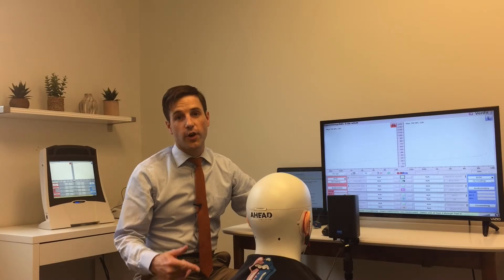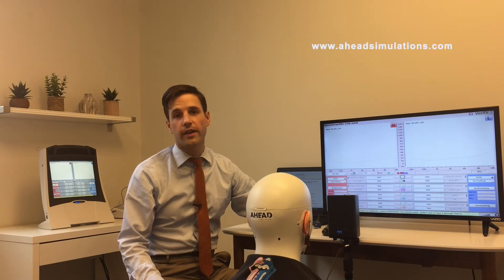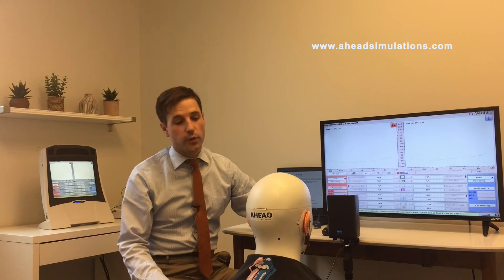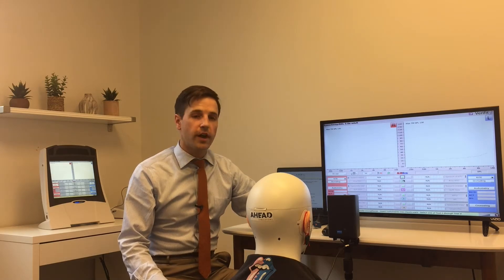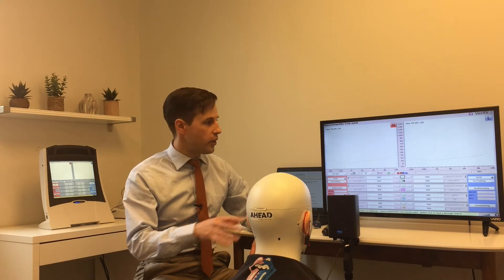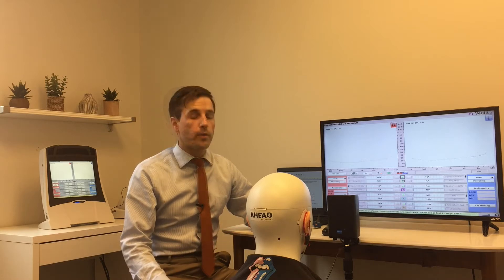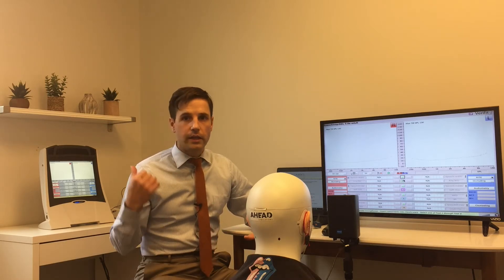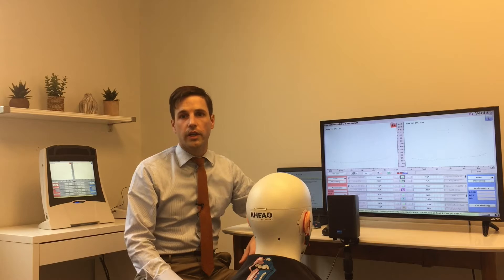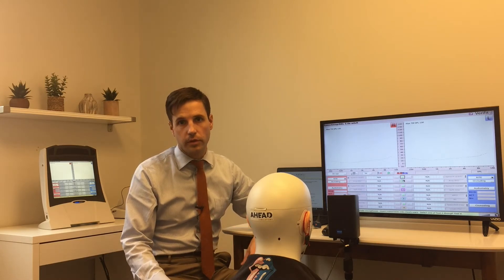Our patient today is Carl. Carl is an audiology simulator and he's also a Stones fan, so he's got sort of age-related, possibly with a little bit of noise-induced hearing loss. We've got the Verifit set up with an external speaker and external monitor. One of the nicest things about the Verifit is that it is a standalone unit and you've got the screen right in front of the patient so they can see what's going on.